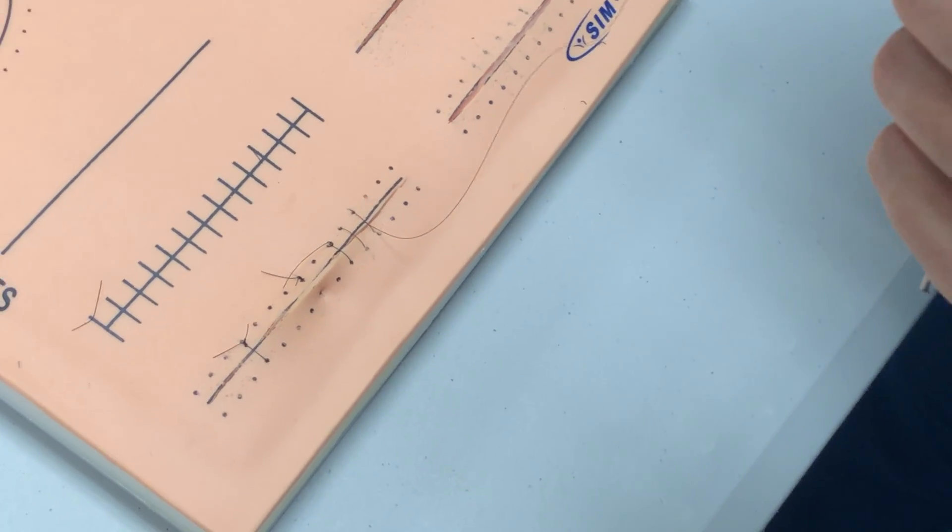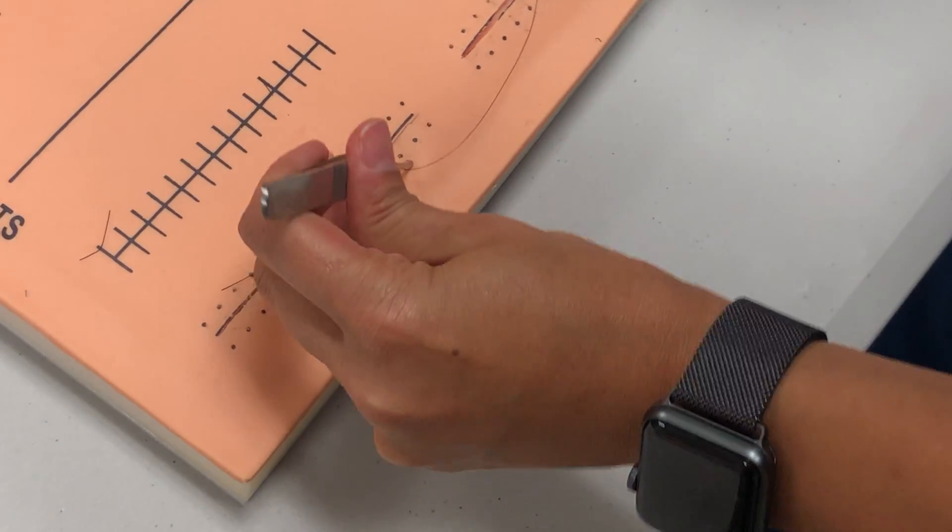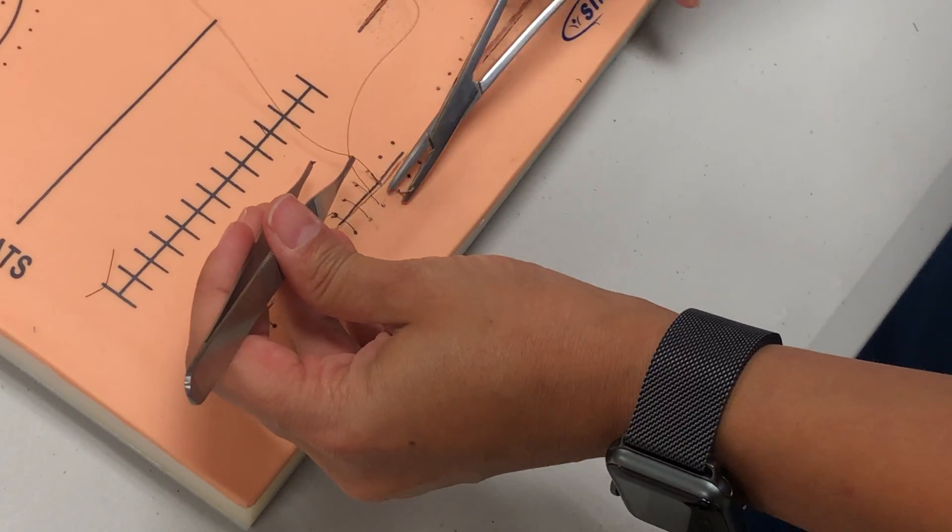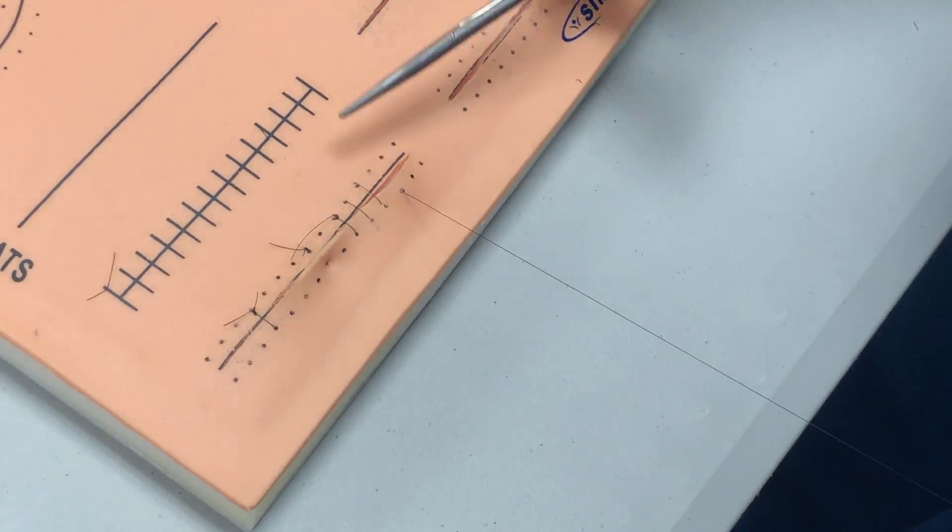Now I'm in the middle, going to finish this one. Remember, I'm coming out diagonally, so I'm coming to the next dot. When you don't have the dots, you kind of have to lay it out. I'll show you how I do it right now.